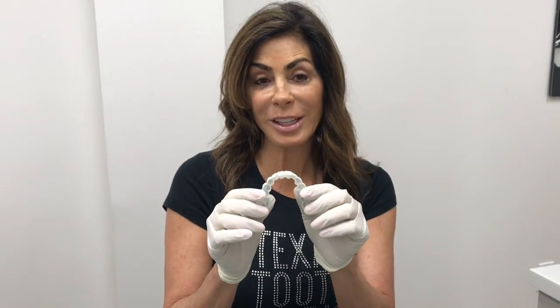Okay, so this is the appliance and we're going to place it in his mouth. I want to show you why it's really important to be seen by a dentist, because these appliances have to be adjusted. A lot of the cosmetic internet appliance companies just deliver it at your doorstep, but no one's there to adjust it. And if you look at some of the warranty work, it says that one of the issues with it is that the patients get sore jaws. Well, you shouldn't get a sore jaw. These appliances should be ready to eat with and ready to go the day you leave the dental office. So I'm going to go ahead and show you what I'm talking about.